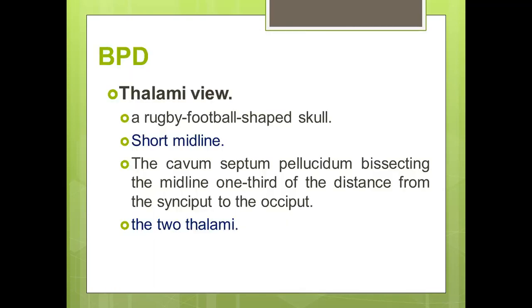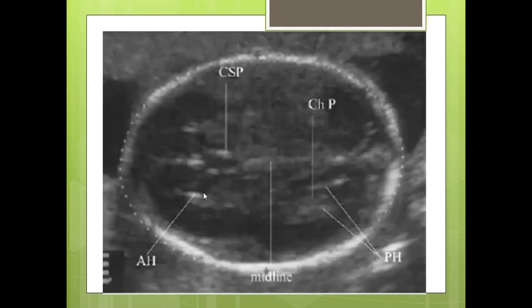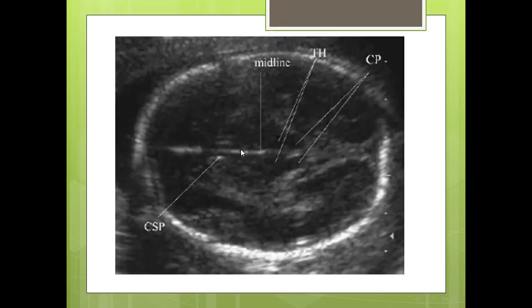The other view is the thalamic view. The same rugby football shape applies, but the midline is short and the two thalami appear in this view. The midline does not reach the posterior aspect, and there are no anterior horns of the lateral ventricles visible. Comparing the two views: the lateral ventricular view has a long midline with anterior horns visible, while the thalamic view has a short midline with thalami visible. Both views are correct.